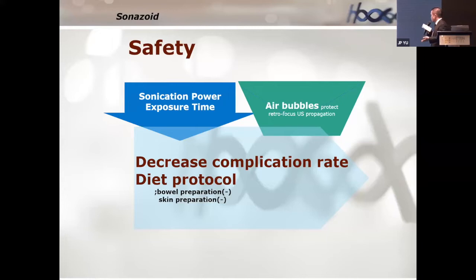So we can simplify the protocol. I always don't do bowel preparation or skin preparation, so we can treat quickly and simply.